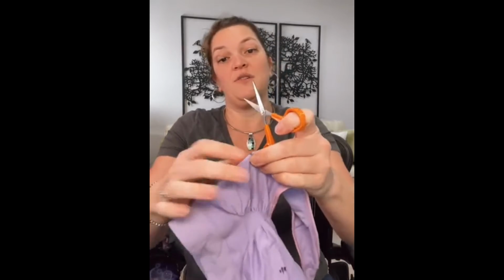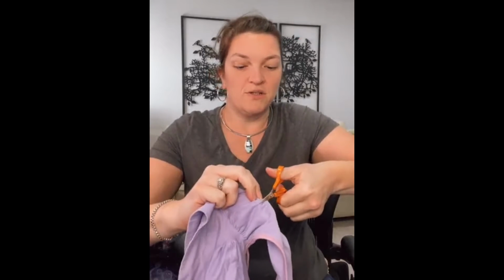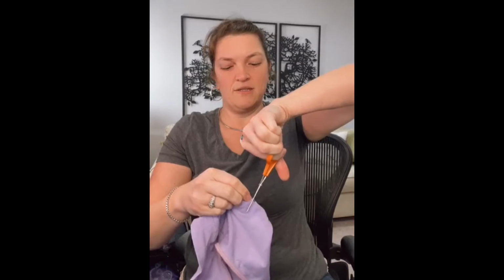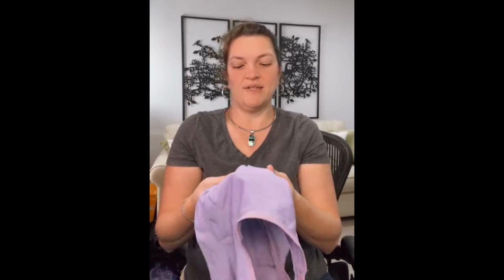Now what I like to do is pinch my fabric together and make my cut. You need really sharp scissors for this. Don't make your cut too big, but you do need to make sure that it goes all the way through, okay? So I'm going to cut little slits to start. Okay. Now you can practice without this on your body, little slits first.